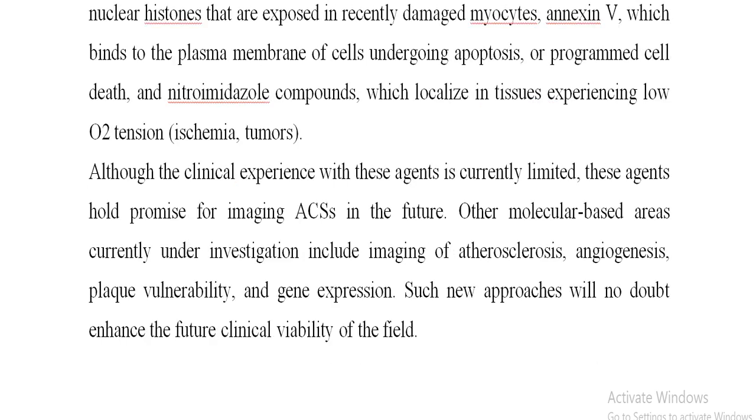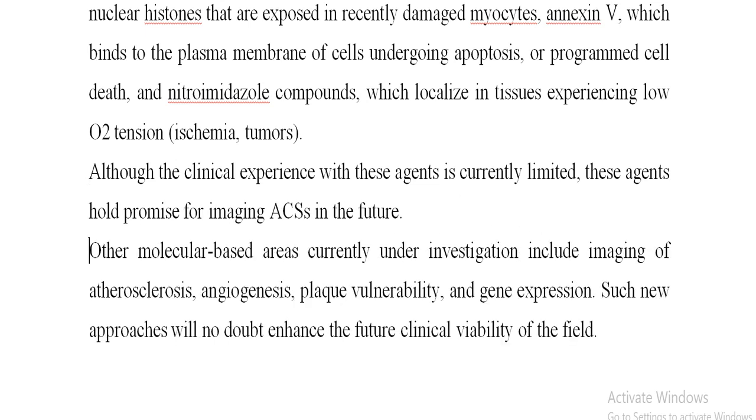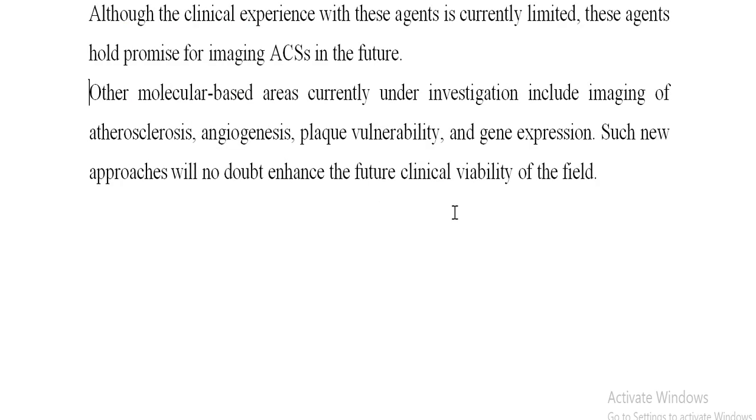Other molecular-based areas currently under investigation include imaging of atherosclerosis, angiogenesis, plaque vulnerability, and gene expression. Such new approaches will no doubt enhance the future clinical viability of the field. Chapter 56.